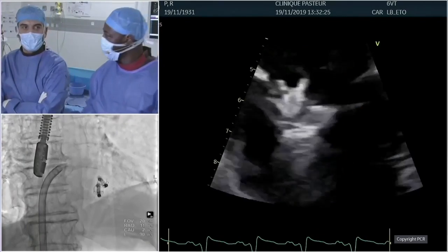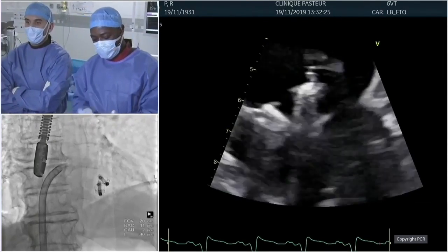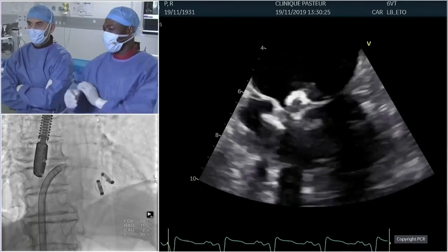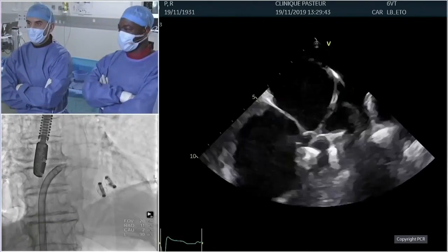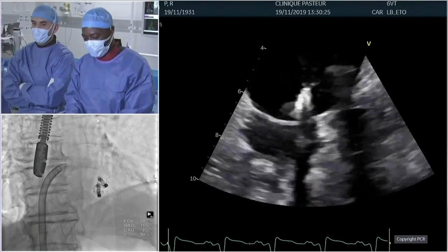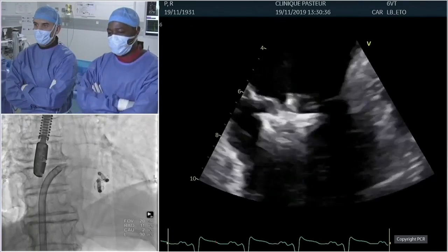Well, because they're on different planes, we usually do the orifices separately, and it gives us extra assurance and confidence that we understand the mean gradient. So if the mean gradient is extraordinarily low, but the EF is 20%, and now your valve areas are planimetering at 1.5 total, you might think twice. But again, if the mean gradient in this case is 3, I think it's probably less than 3.5, and it looks like you've got one very nice large orifice, then you feel more confident that the mean gradient is reflective of the actual valve area.